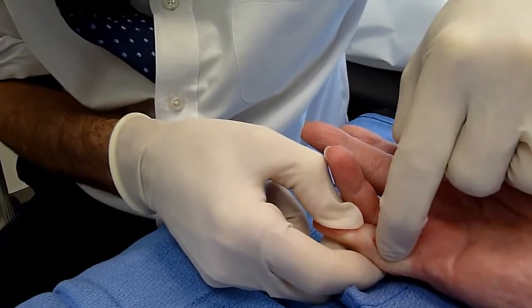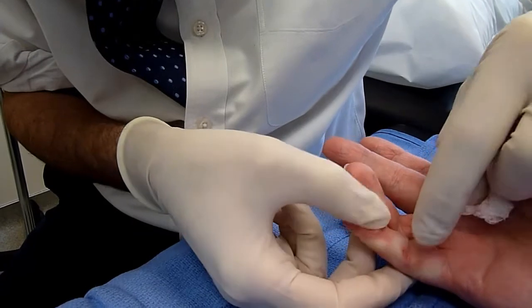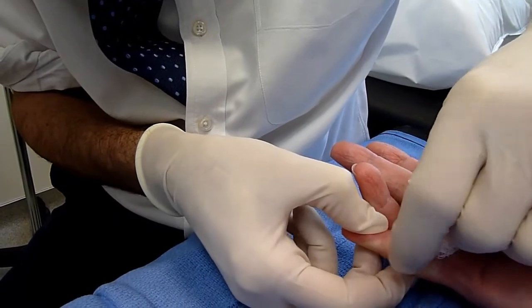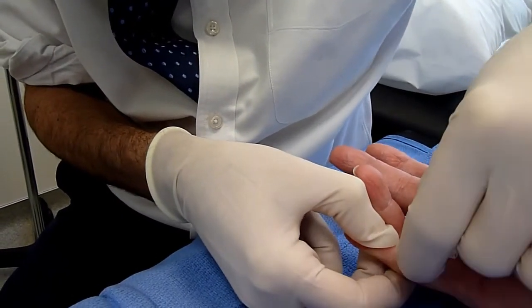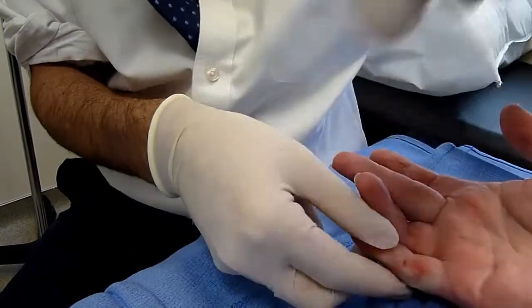So your cord is totally disrupted now. I do not feel it there at all. Okay, cool. So that is good. And now I can actually get you all the way straight, but it doesn't want to. It wants to still be tight. So therapy is going to be splinting you to get a finger that has been crooked for a while straight. I do not feel anything left there. All right, so small finger done.